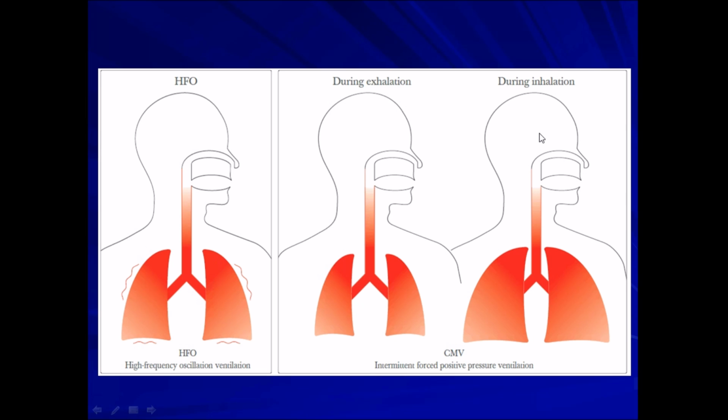Again, during inhalation we apply tidal volume. We increase the pressure in the air until it reaches the plateau pressure. During expiration the volume will decrease. So there is a big difference between inspiration and expiration. While in the high frequency oscillator, we are applying direct pressure, which is the mean airway pressure. We keep the lung open and then we shake it by the frequency we are applying.